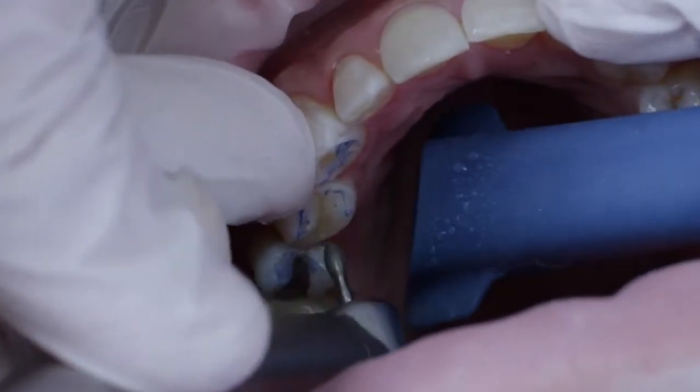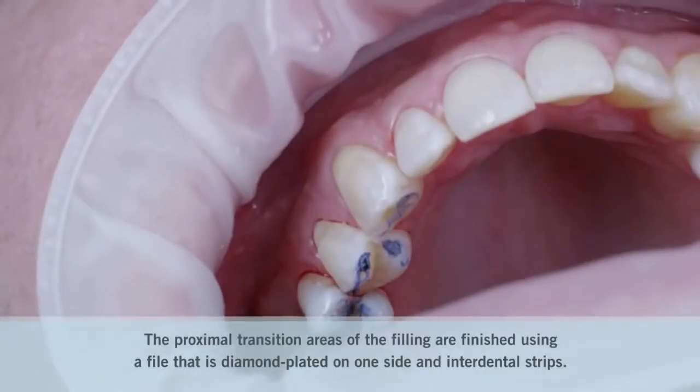A lens-shaped diamond tool was used to finish the transition areas of the filling and verify the occlusion.